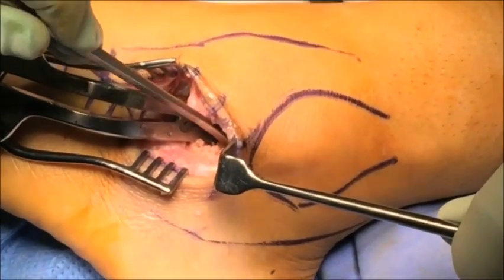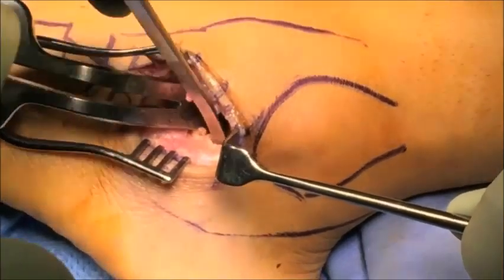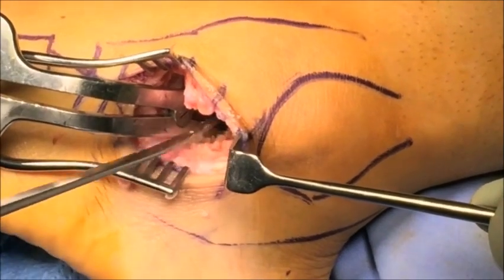In cases with very sclerotic subchondral bone, a thin sharp osteotome can be used to feather the joint surfaces. This is done to try and improve the success of the fusion.